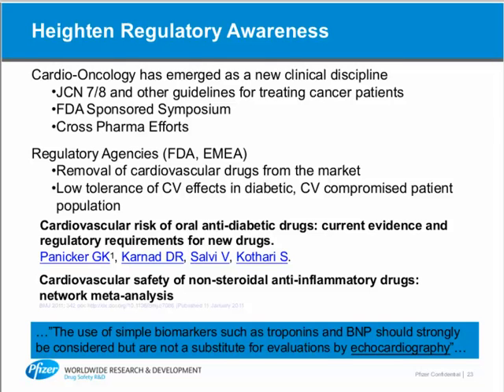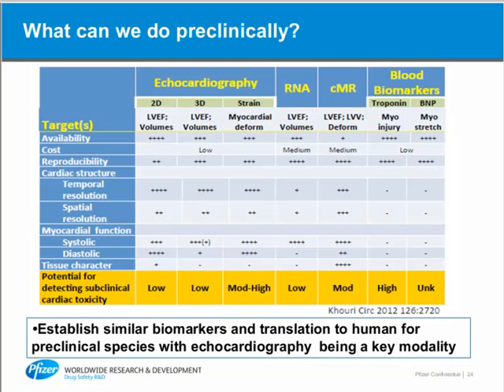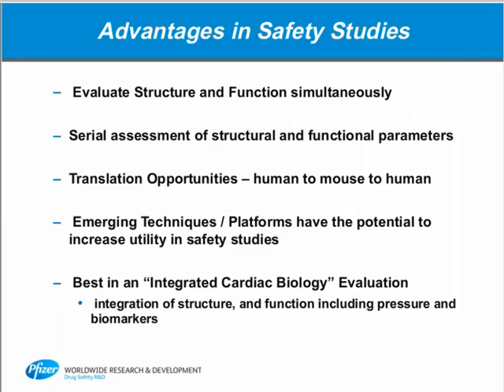And so we were very pleased to hear this, as it is something we have been doing preclinically for some time now. What's laid out in this table, and I won't go through it in detail in the interest of time, are various modalities that are used in the clinic and their pros and cons for various categories here down the left side. All I'd like to point out here is echocardiography carries a lot of these advantages, not only in the clinic, but preclinically, and it's something we've been doing for over a decade now, and we see that as a key modality. And we see it that way for some of the same reasons that Andrew outlined previously.